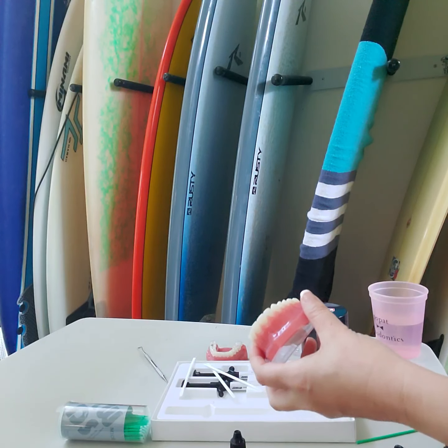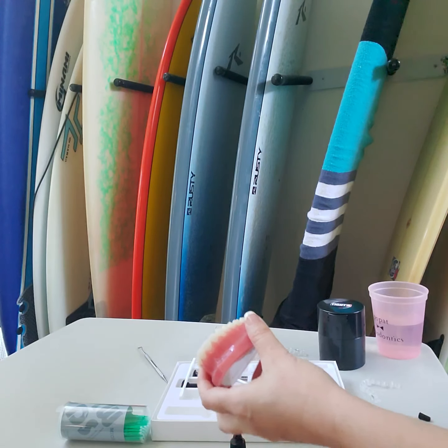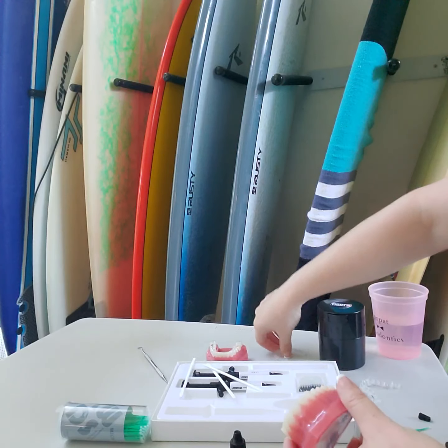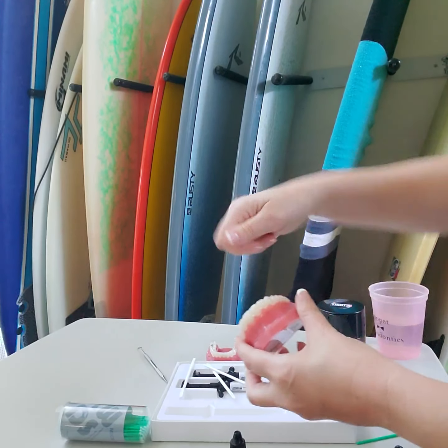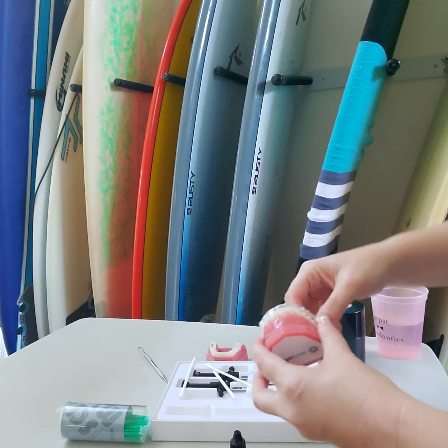And then you should be already isolated. You're ready to open this up, slap that thing on, okay? Make sure the patient's biting hard on cotton rolls and light cure. And don't just light cure a little bit, light cure from all different directions when you put it on, okay? So you want to be light curing from straight on, under, over, and then when you're all done, you're going to go ahead and peel this sucker off and everything should stay on, okay?